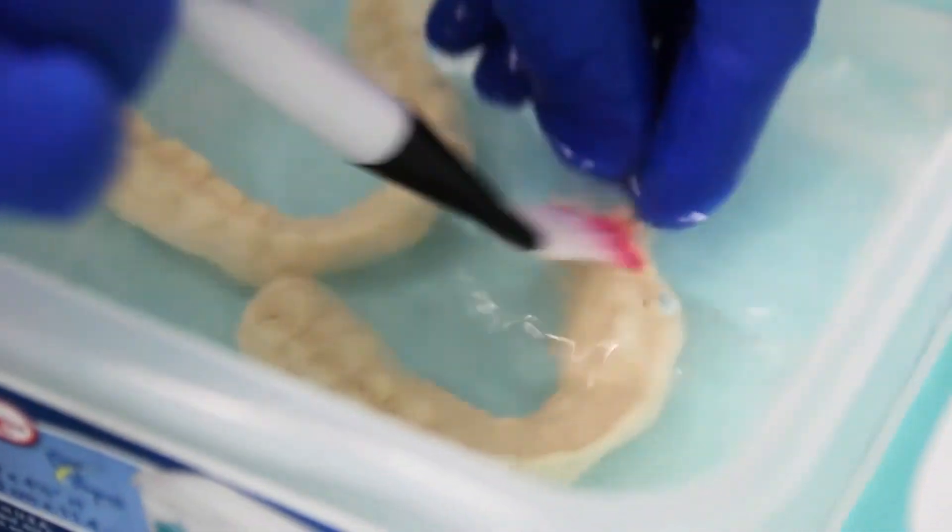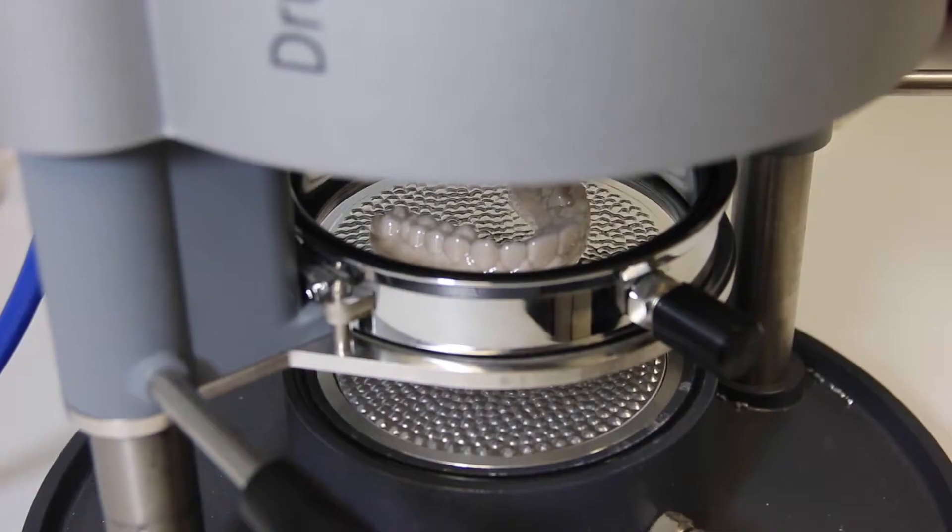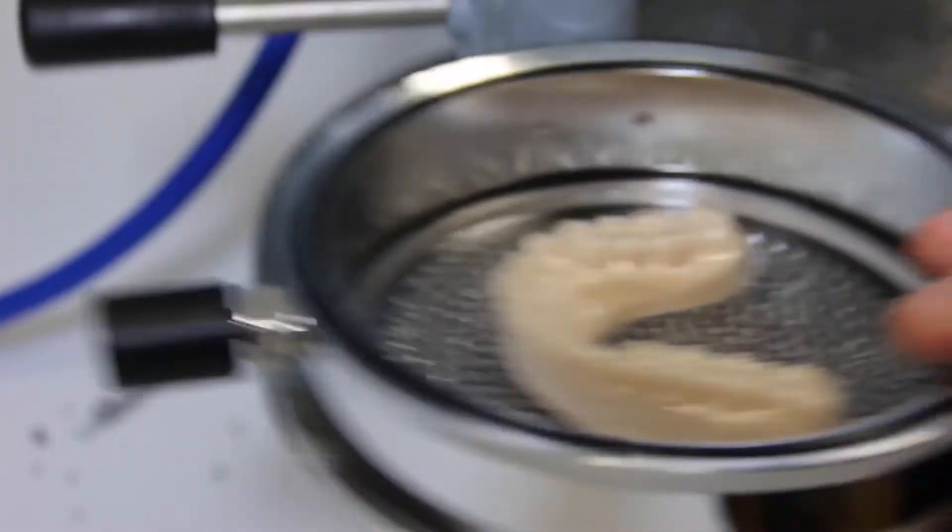We use an alcohol base that we clean the model with and then it goes into a curing oven. We bring it over to our Essex maker and we can form our retainer and then trim and then it gets ready to go into the patient's mouth.